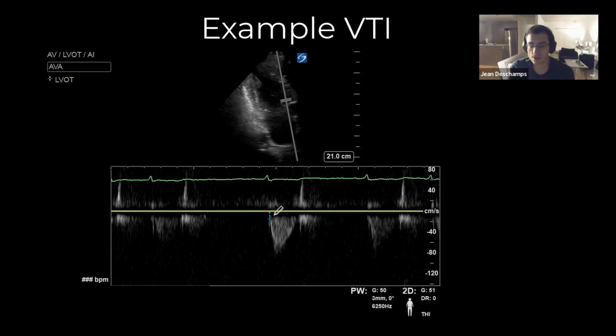The other thing that you notice is that you don't have that dip in the middle of darkness with a clean, thin envelope around it. And that's probably because you're a little bit too close to your aortic valve and you're catching that kind of turbulence and acceleration that you would catch normally in a CW tracing. That tells me when I look at this tracing that I'm probably a little bit too close and I should get back. What you're looking for is the perfect balance between that narrow, very echogenic band around with the dark notch in the middle.